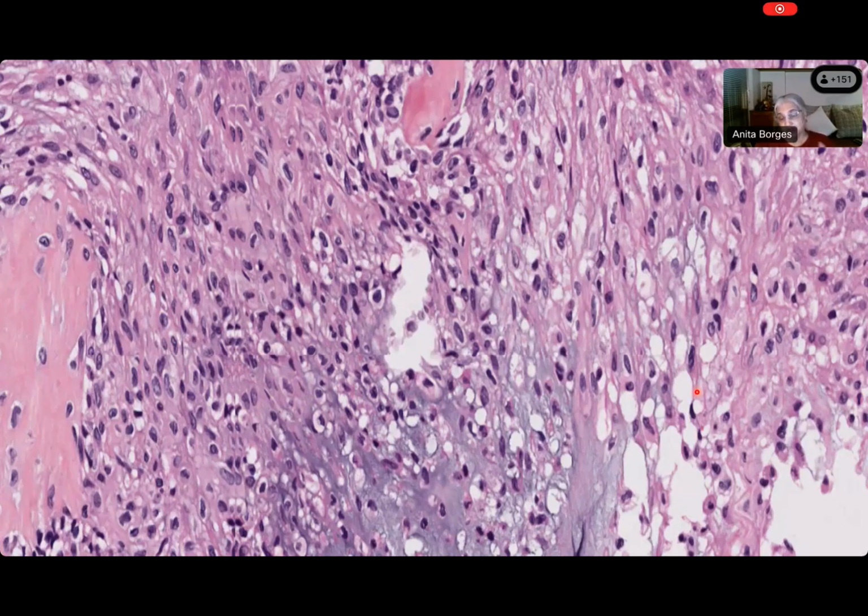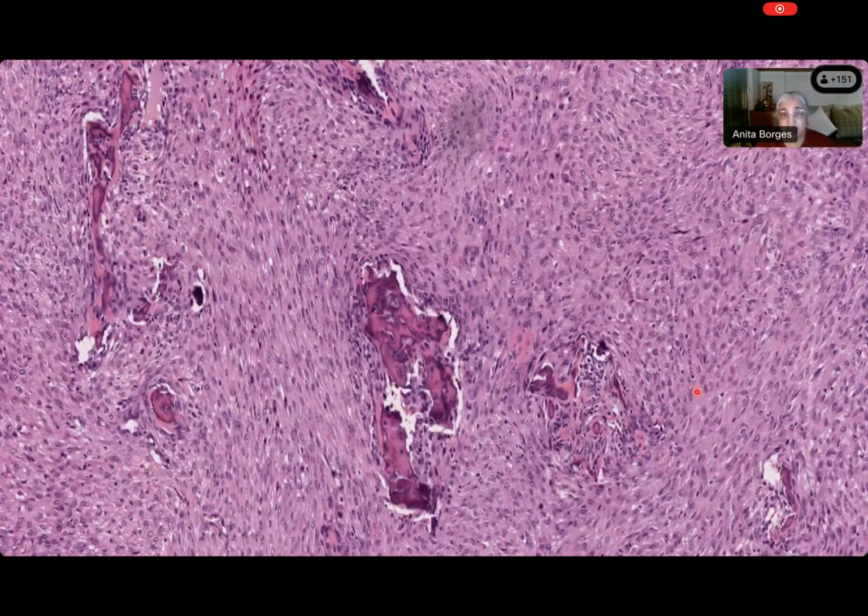So now we have abnormal cartilage, we have giant cells, we've got all sorts of other things, and then comes an area like this. What does it show? A uniform pattern, very cellular. No longer are those stromal cells forming fascicles. They are also giving rise to bone. You see this calcified osteoid. So now we have cartilage which is abnormal, very abnormal looking stromal cells, and cells that are also producing bone. It's calcified osteoid, and very soon that would become bone.